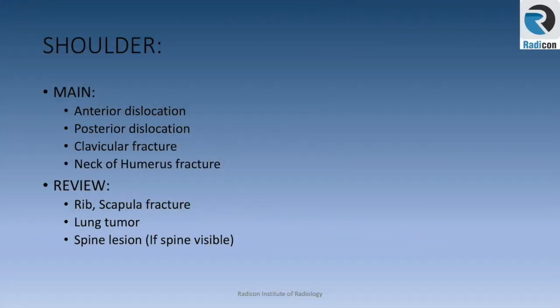Let's review important points in shoulder X-rays for rapid reporting. Main abnormalities to look for are anterior and posterior dislocation, clavicular fractures, and neck of humerus fractures. Review areas include rib and scapula fractures, lung tumours, and spine lesions if the spine is visible.